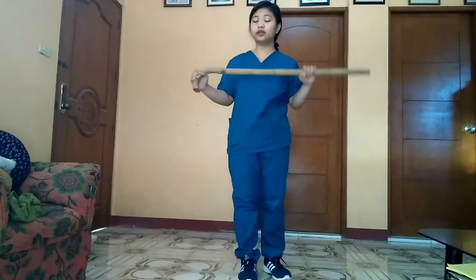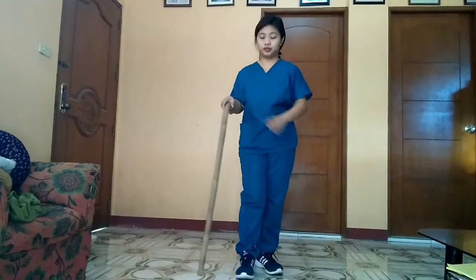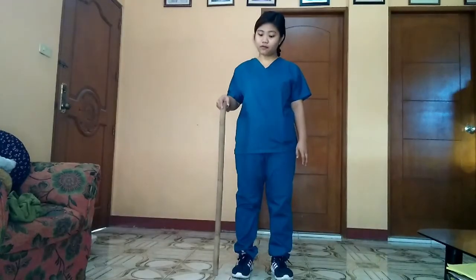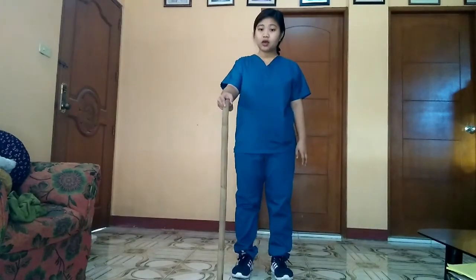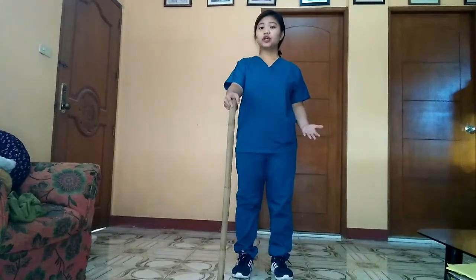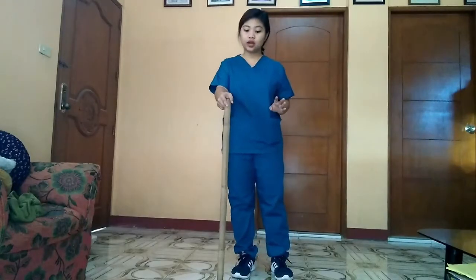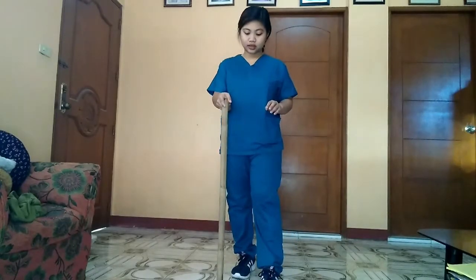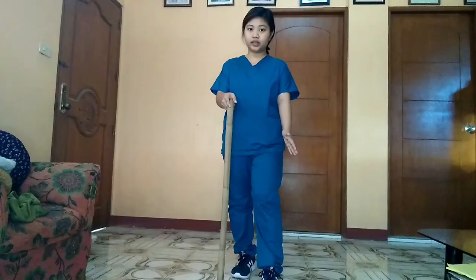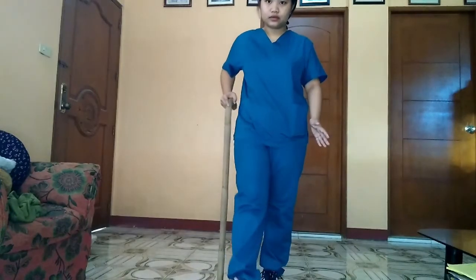Assume that the level of the cane is properly fit to me. Instruct your patient to place the cane appropriately forward to keep his or her weight on both sides. Instruct also your patient that when you move the cane forward, make sure to advance also the weak side of his or her foot. The weak side of the foot and the cane are matched appropriately, and then followed with the strong foot.